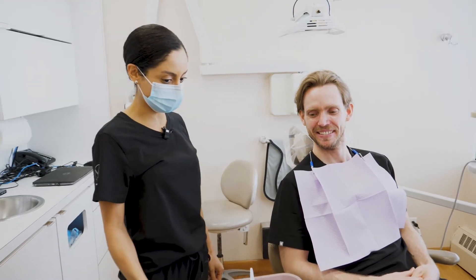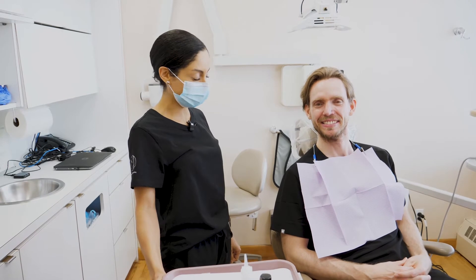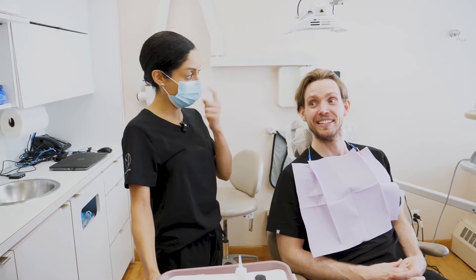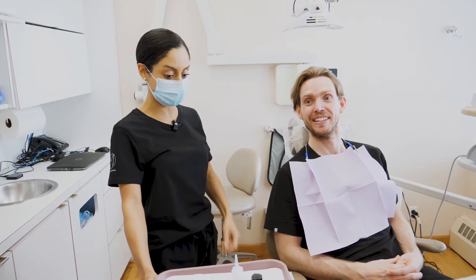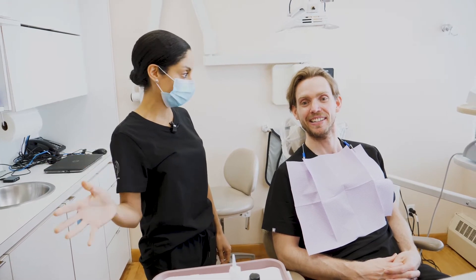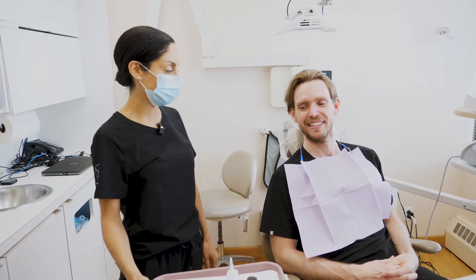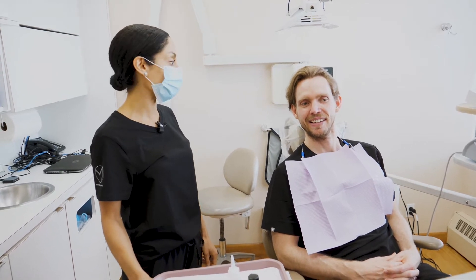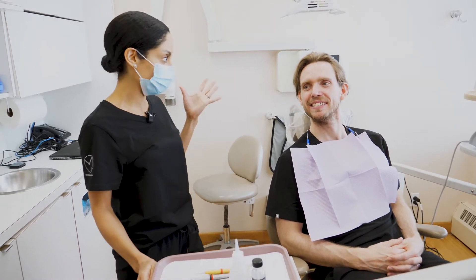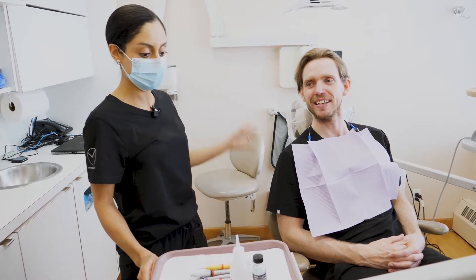So what we're going to do today, Dr. Graff, is we're going to take a plaque sample from in between your back molars in all four quadrants of your mouth, and we're going to put it on a little microscope slide. Then we're going to go over to the microscope and take a look at what we see. Everyone has bacteria in their mouth. We're looking for certain types of bad bacteria that cause inflammation, bleeding, gingivitis, that kind of thing.